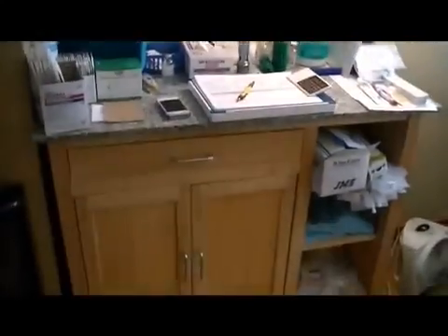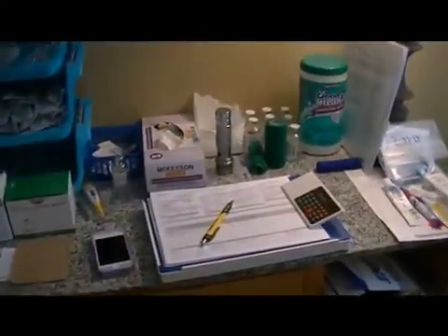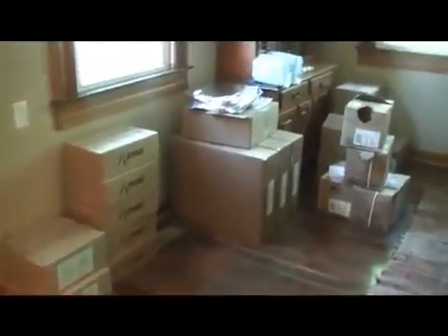Right here beside the machine is where we keep all of our supplies for the treatment, and you've got all your needles and anything that we would need during the treatment right here. This is the dining room where we keep all of the supplies. It takes all of these boxes, and this is our backup supplies here for the treatments, and we have our needles, and we have a centrifuge here that we use when we do labs. We have to spin them before we send them off.